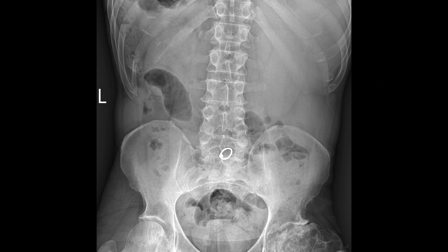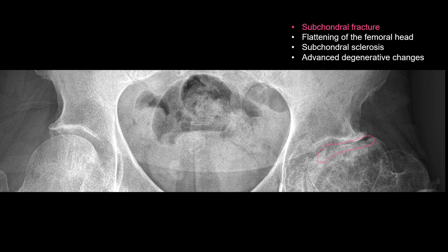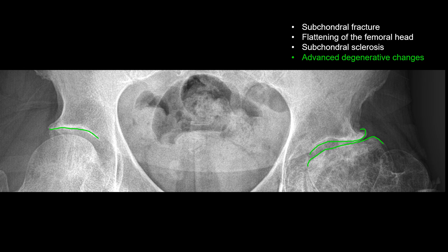Let's take a look at a normal hip and femoral head in comparison to one with avascular necrosis, then look at some examples. This patient presented with severe right hip pain and low back pain. Notice considerable asymmetry between the two visualized femoral heads. A small subchondral fracture is visible at the superior aspect of the femoral head. The femoral head is flattened and slightly deformed. The area of increased density at the articular surface represents subchondral sclerosis.